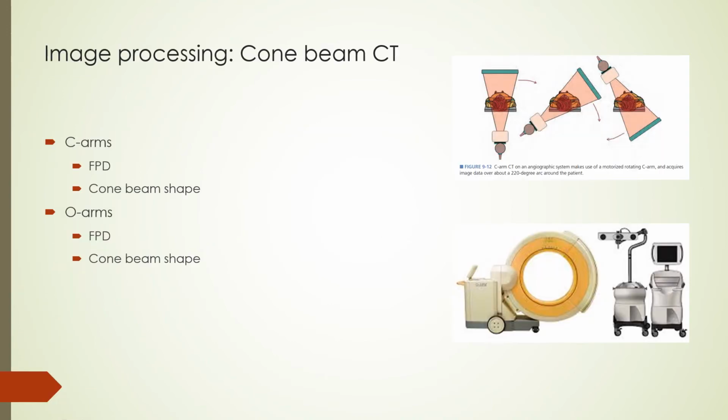In some applications in the operating room, a C-arm can be used to acquire tomographic images of screw placement or hardware within a patient. Having this feature on a C-arm is convenient because the patient does not have to be moved to the CT scanner to acquire 3D images. The O-arm, which was introduced in 2006, also has the capability to acquire both 2D fluoroscopy images and 3D tomographic images with one imaging machine.